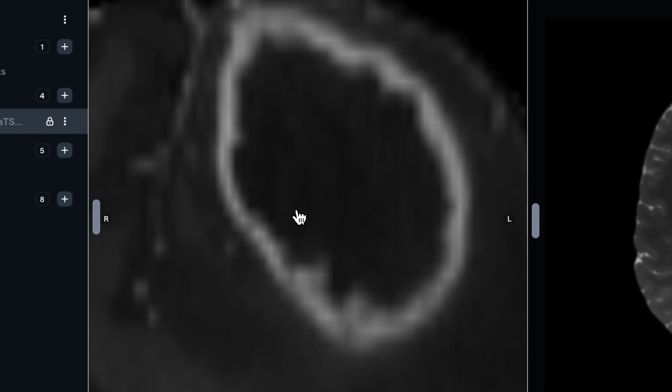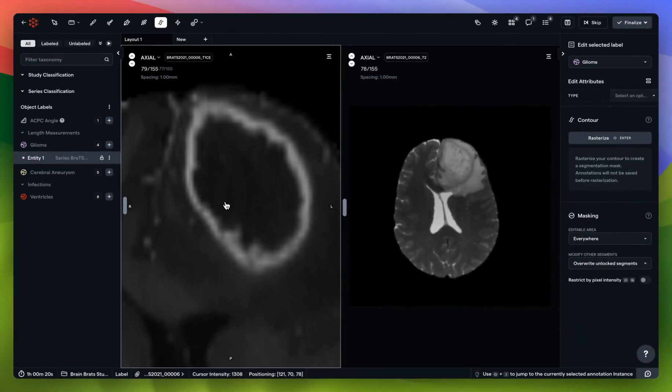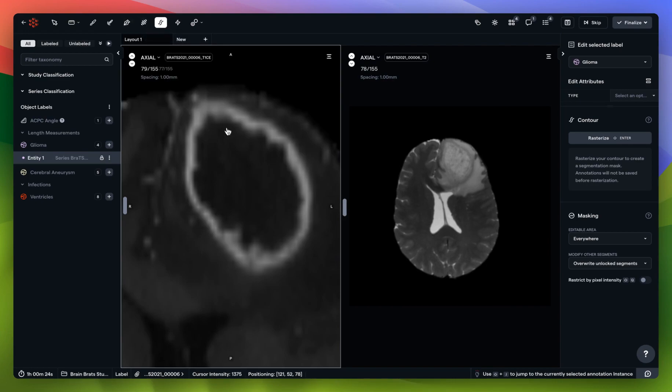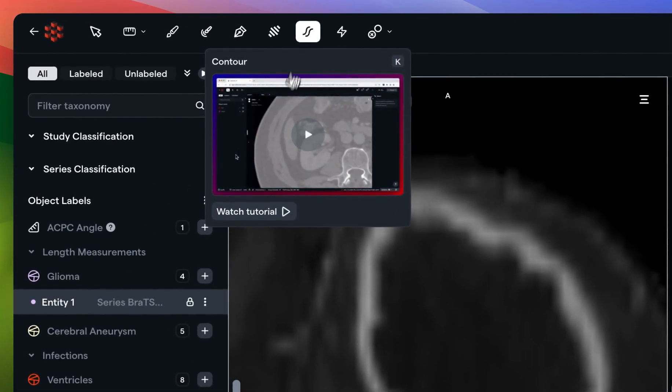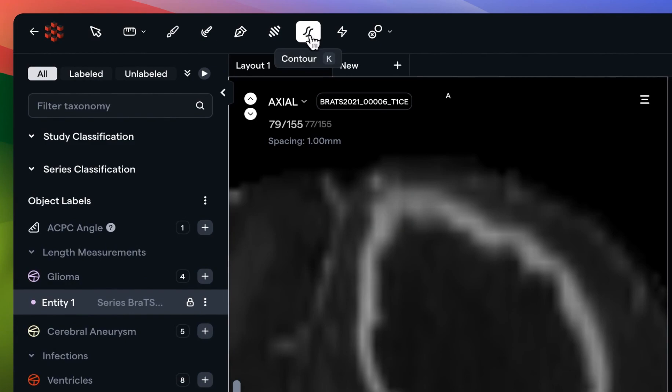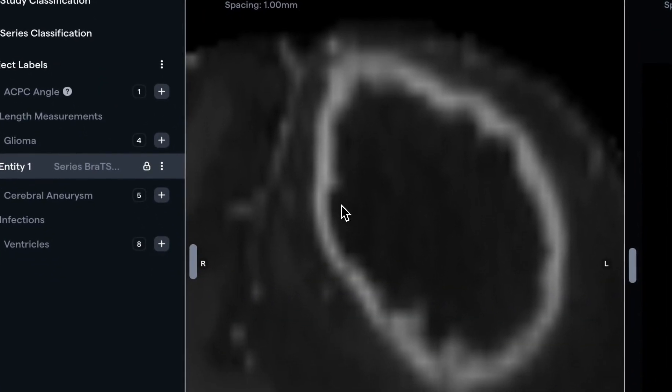However, the power of redbrick lies in leveraging these semi-automated and manual tools that we have to get highly accurate annotations done quickly. If you've watched the contour tool tutorial or read our documentation, you'll know that the contour tool has several useful features.